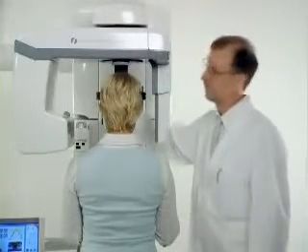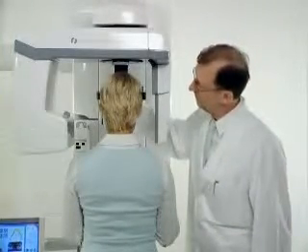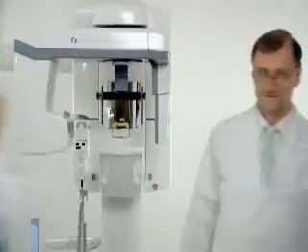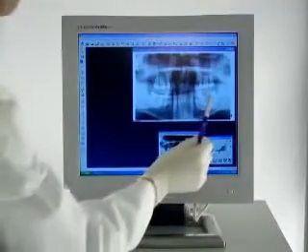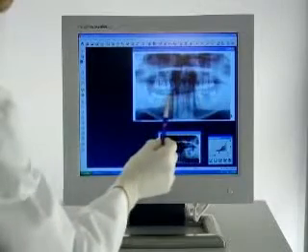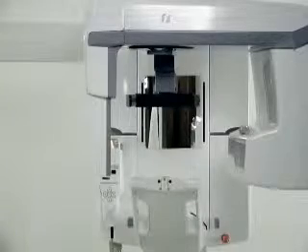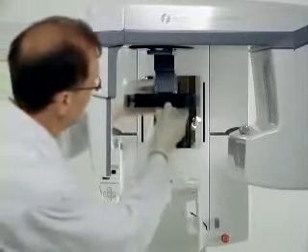Taking VT projection images. Prepare the unit for VT projection imaging by removing the head support and VT panoramic accessory. Place the VT projection accessory into the unit and note that the imaging mode changes into VT projection mode. The unit automatically selects mandibular program. Move the collimator to VT projection imaging mode.